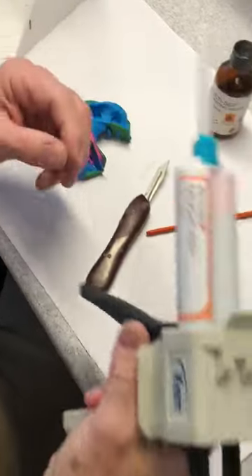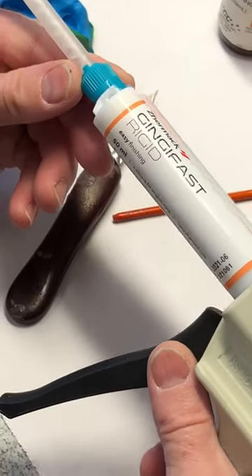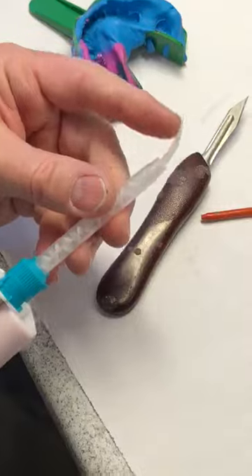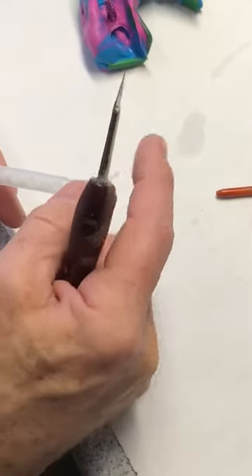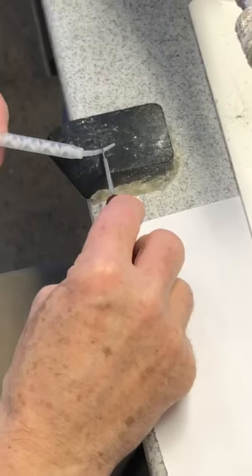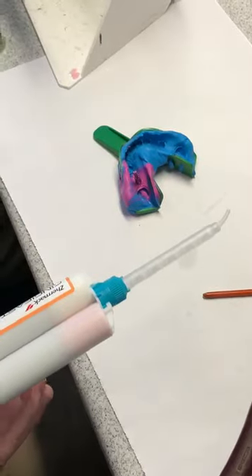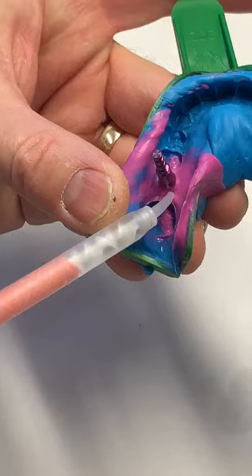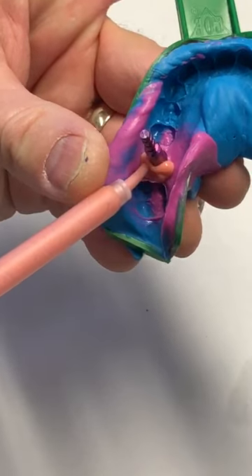The particular material that we're using is called Gingifast Rigid. It uses a regular VPS tip, and I want to make this a little bit wider, so I'm going to cut the end partially off so it'll dispense a little more material. This particular stuff flows pretty good. I'm going to try and get this in there without having any voids.